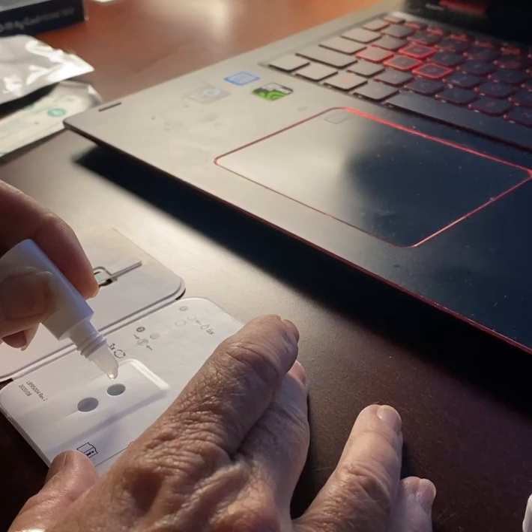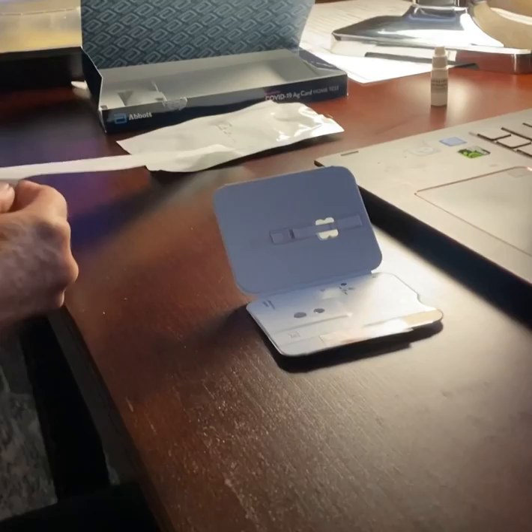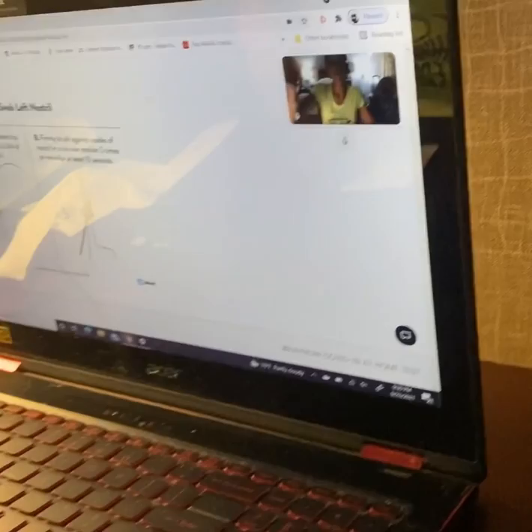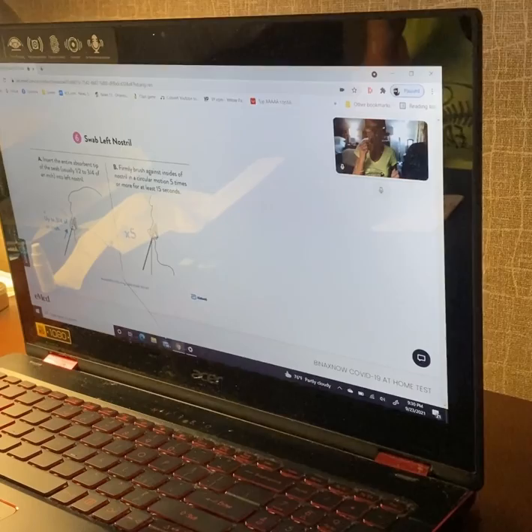Okay, now take the swab out without touching the foam tips. I hate this. Alright, now we are going to swab it, beginning with your left. Please tilt your camera up now, ma'am. Okay. Now insert the swab at least half an inch into the left nostril and rotate five times against the sides of your nostril. Once you're done with the left, ma'am, please do the same for the right nostril.